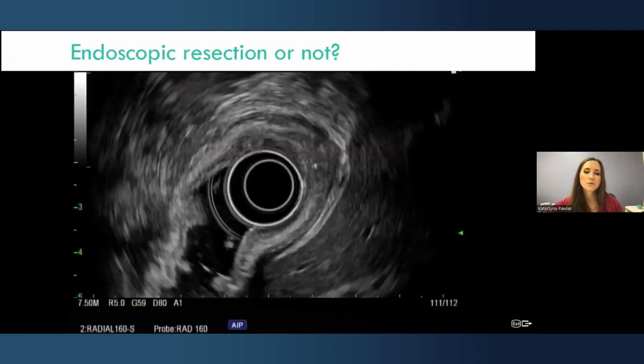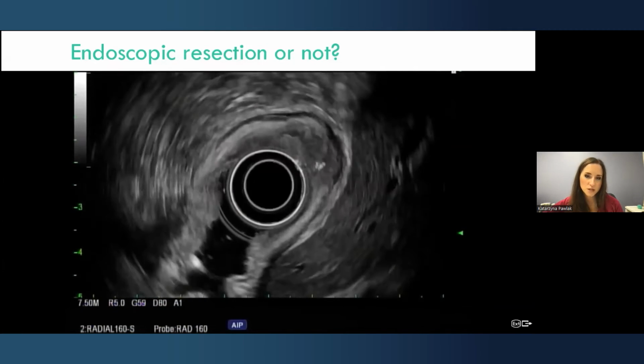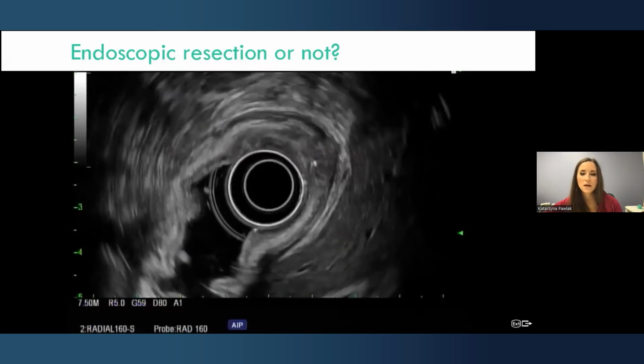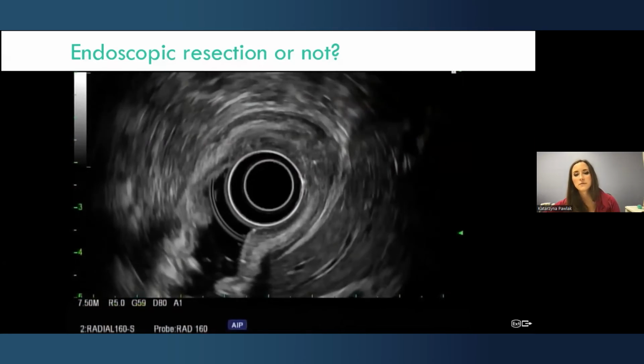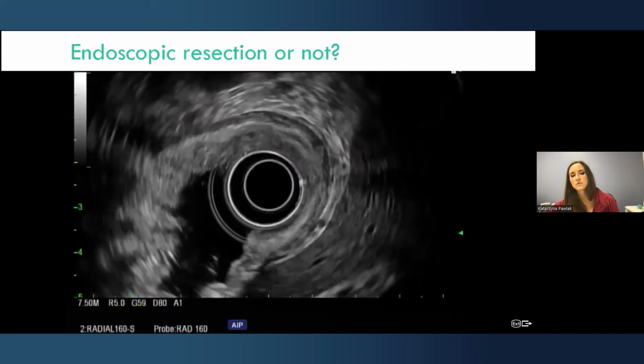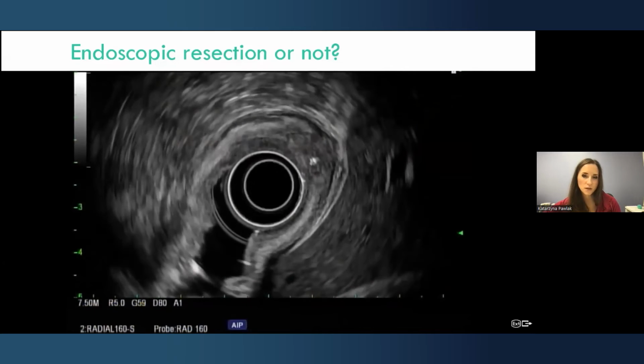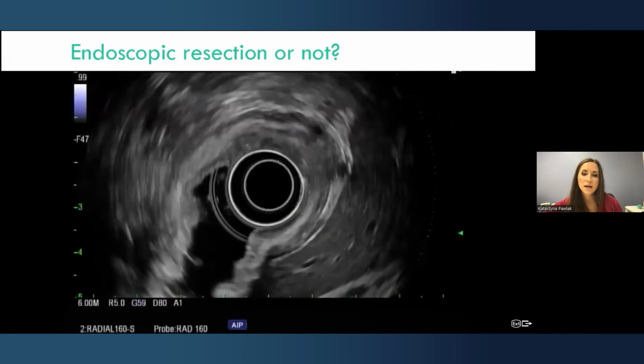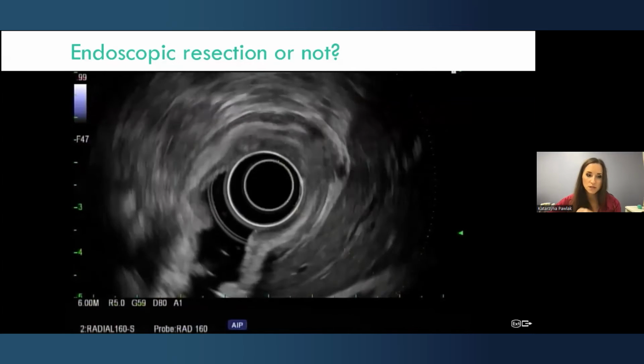I also filled the lumen with water because the location was difficult. And after even this assessment, I tried to assess also the left liver lobe and also lymph nodes at this location, if there were any visible or not. But this is nicely seen now, how the lesion is advanced in this situation.